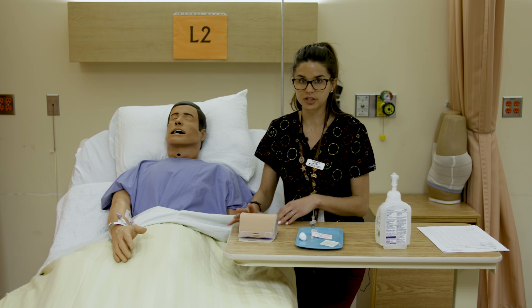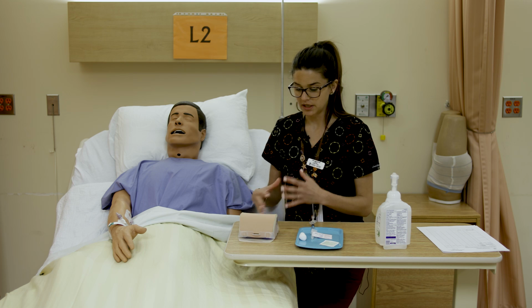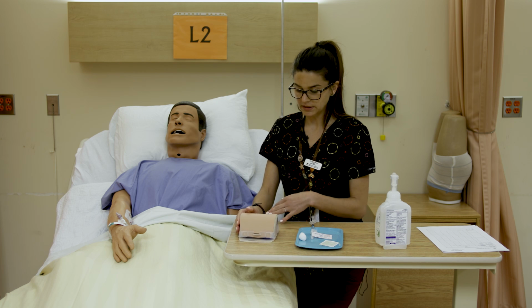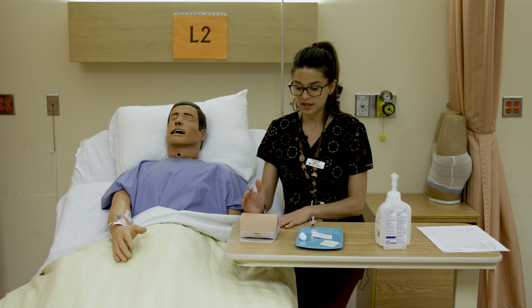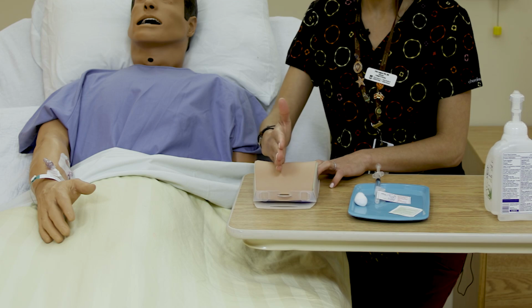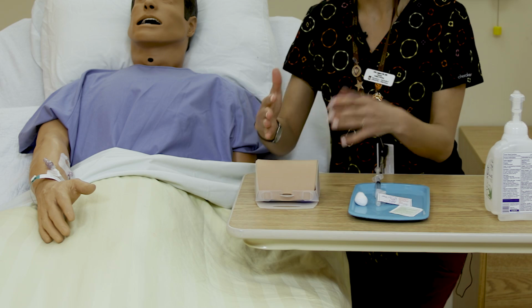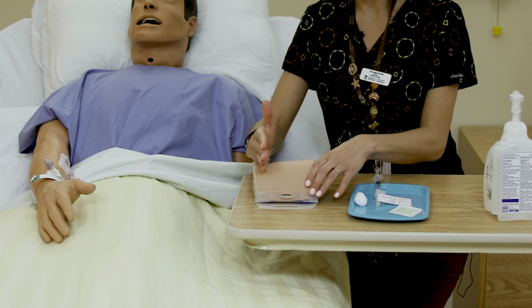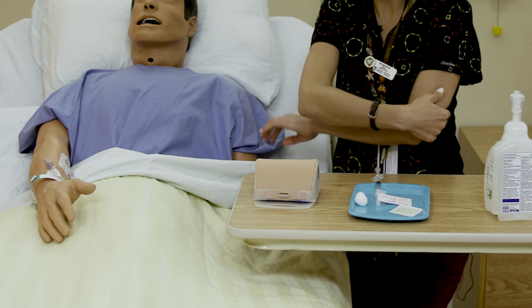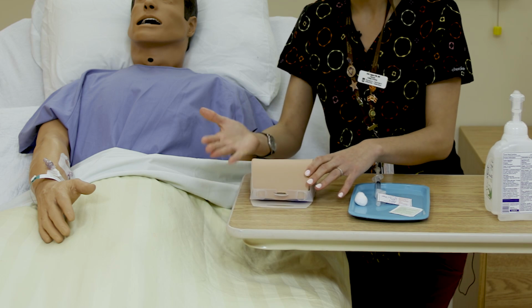with IM injections. And you want to, again, know your site specific policies and procedures if they do Z-track or if they don't. Some places choose not to. But basically, the theory behind Z-tracking is that you are displacing tissue. So usually using the ulnar aspect of your hand, this part of your hand, and displacing the tissue of the area you've landmarked already, and you're going to actually pull the tissue to the side. This skin pad doesn't move as easily as real skin, but you get that idea of you're kind of pulling the skin tight to one side.